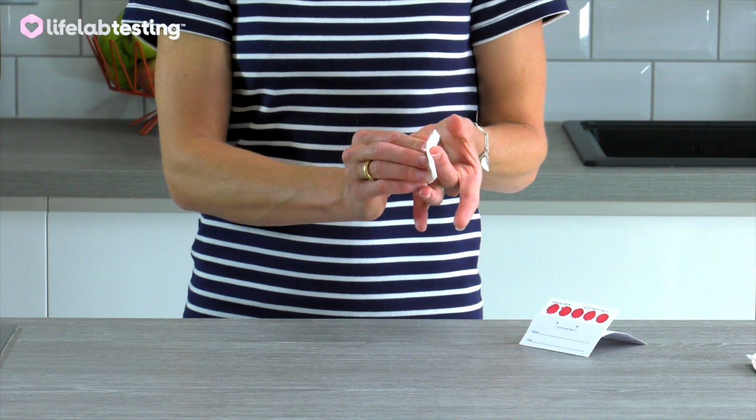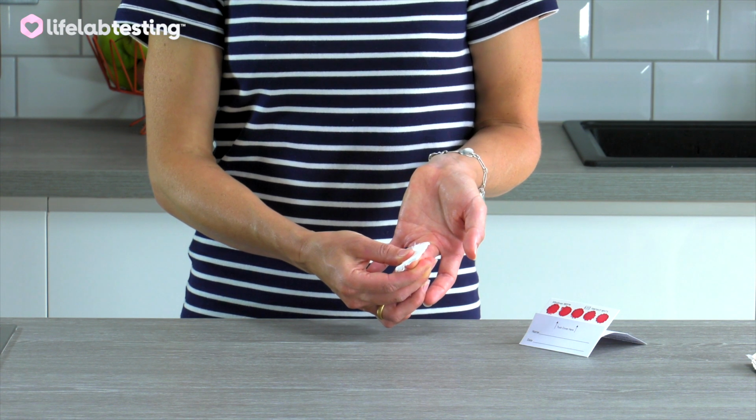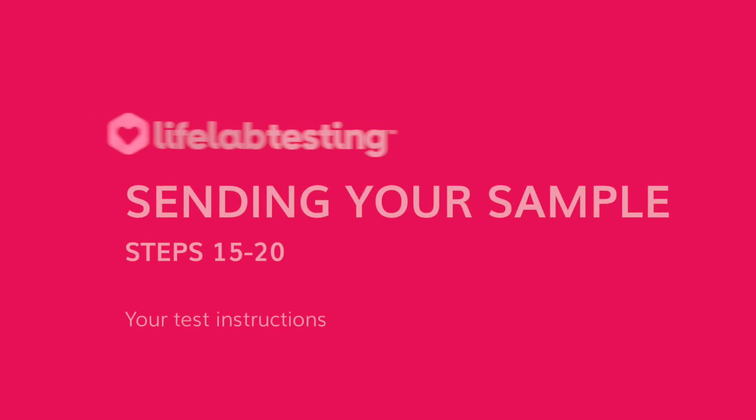After collecting your blood sample, press the swab firmly against the location of the bleeding to stem the blood flow. When the bleeding begins to slow, apply a bandage to the puncture.